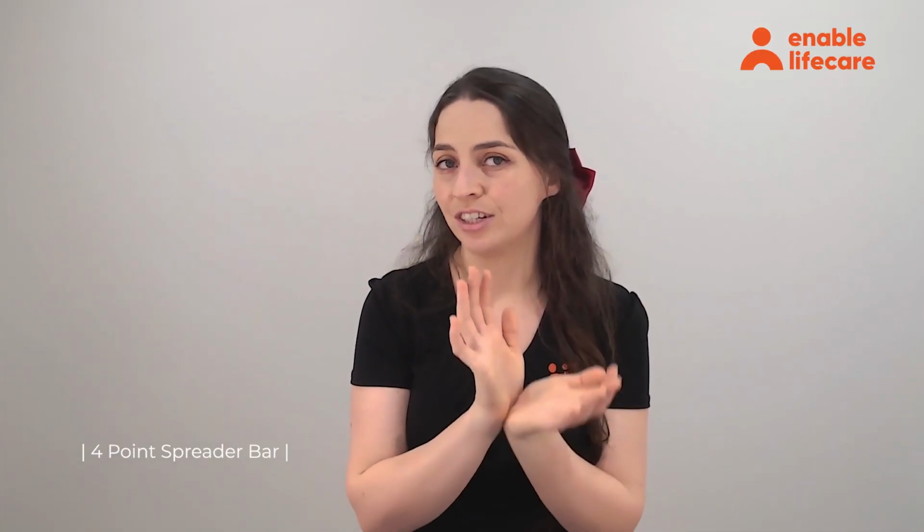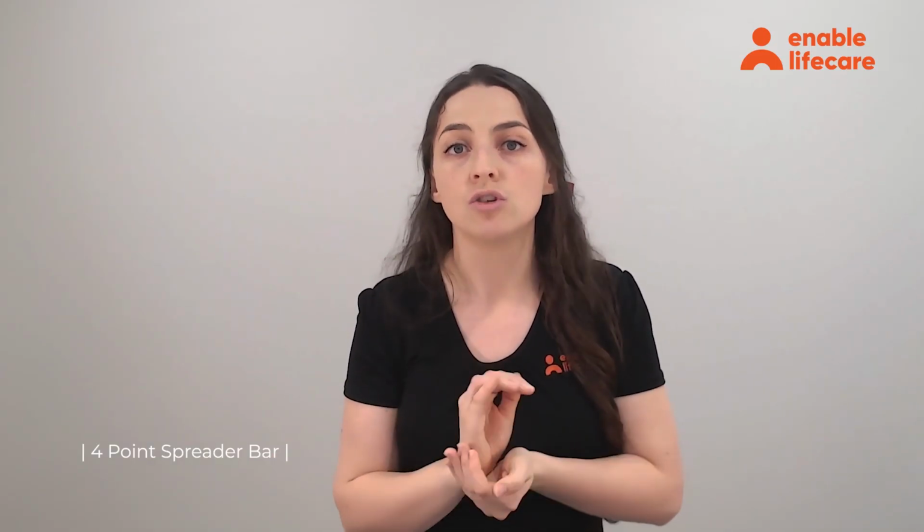Important to note, with your 4-point spreader bar, it might be slightly more difficult to get someone into that 90-degree upright sitting position. You're going to really have to choose your loop attachments or loop lengths very carefully to make sure that you're getting that nice upright seating posture, because you can potentially get someone in a more reclined position. Also, if you do have a client that does have that high muscle tone and spasms, because of this more open sling, it might increase that tone because they're not going to have as much of a closed posture.